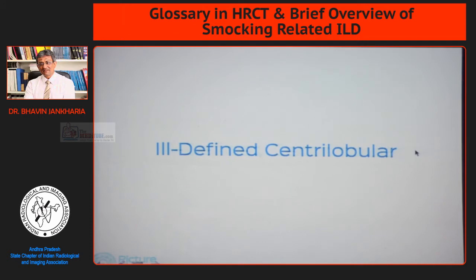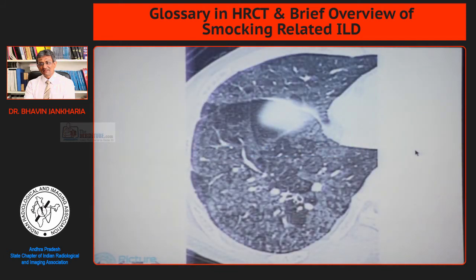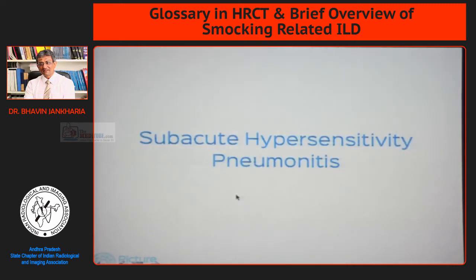The other form of disease seen with diffuse lung diseases is nodular disease. In nodular disease you can have ill-defined nodules or well-defined nodules. Ill-defined nodules appear as ill-defined areas or centrilobular opacities scattered throughout the lung. Diffusely, this looks like ground glass with some spared areas, and within the ground glass you see these ill-defined opacities. This is what you get with hypersensitivity pneumonitis.